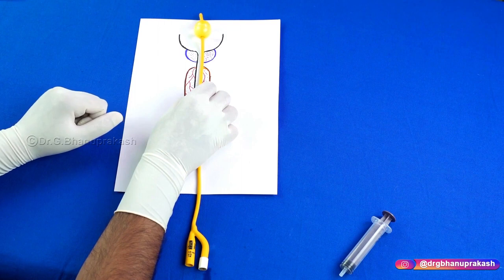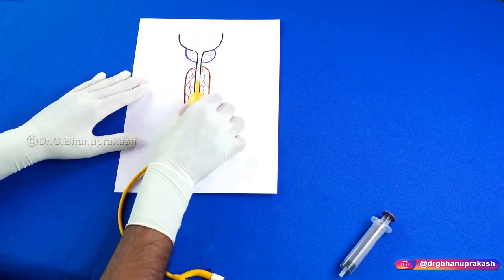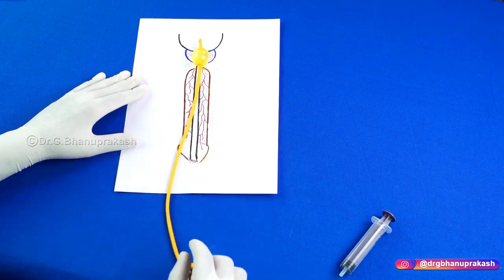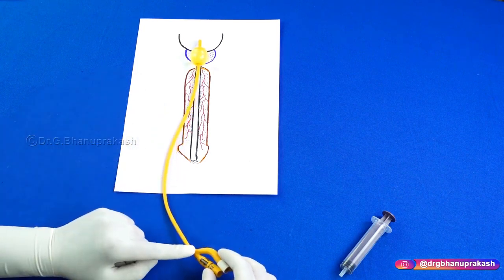The third important thing I am trying to tell you is that now you are putting this Foley's catheter all the way. When you are putting this Foley's catheter, do not inflate it in between. Do not inflate the Foley's catheter until you reach the Y junction. Why?